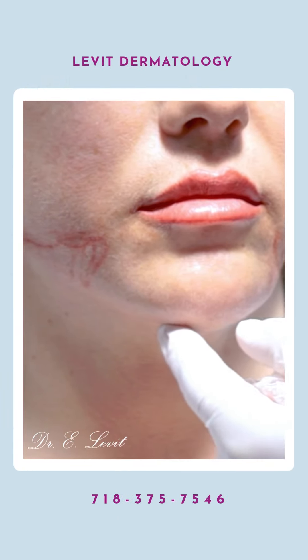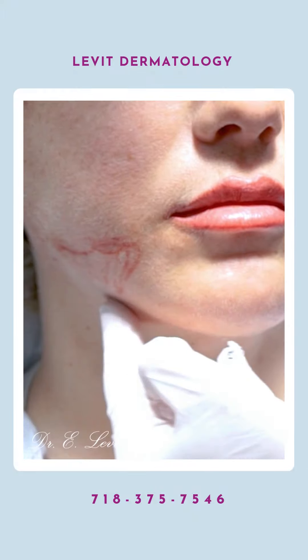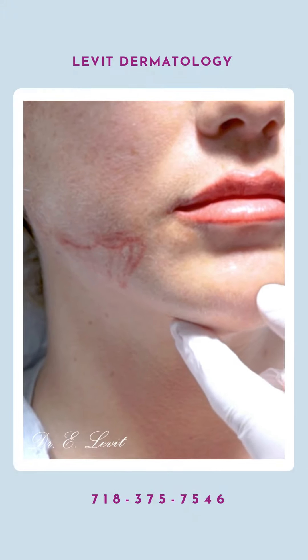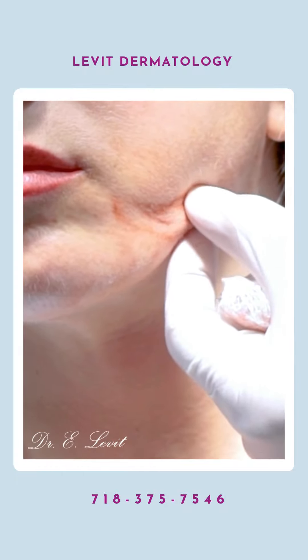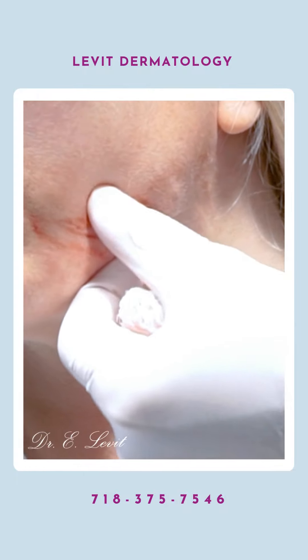So we just did one side — you can see how nice it is. This is an immediate result. This is injecting fat with some exosomes into the area. We also inject submuscularly to give it longevity, and now we're going to try and separate again the skin from the adhesion to the bone.